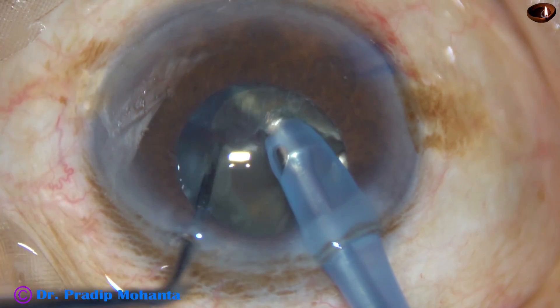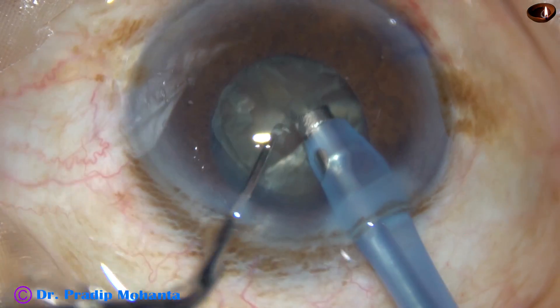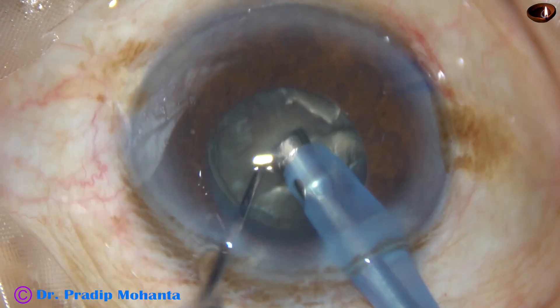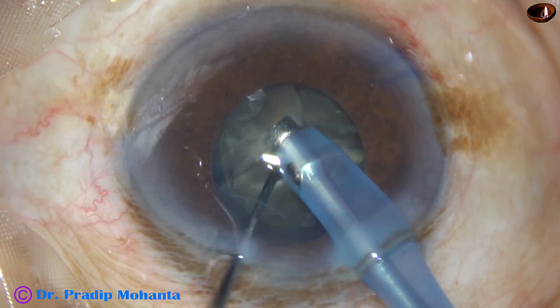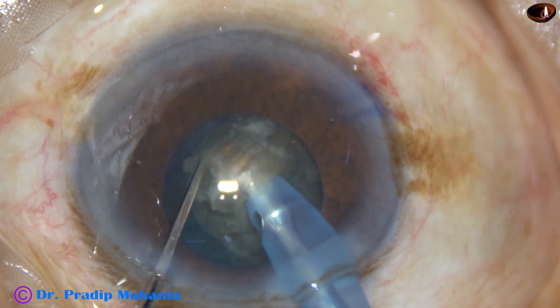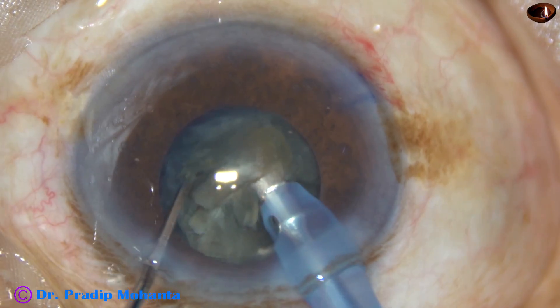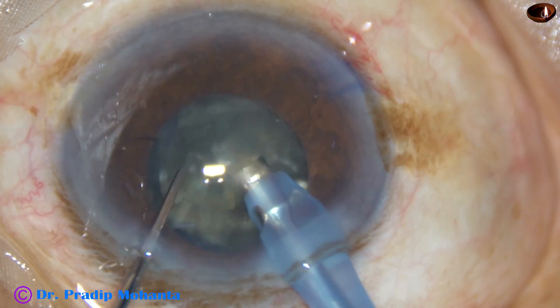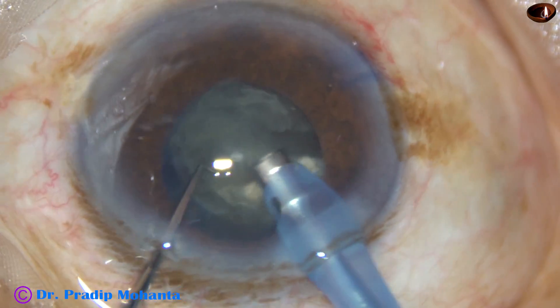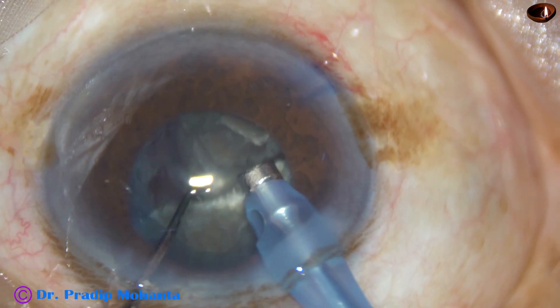At this time I notice that the rhexis margin is not visible in the inferior aspect, and the rhexis margin is advancing toward the center from one o'clock. So here I decide to come out and support the capsular bag with a CTR — a capsular tension ring.